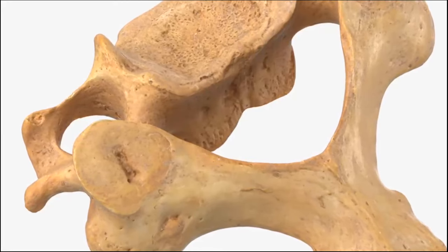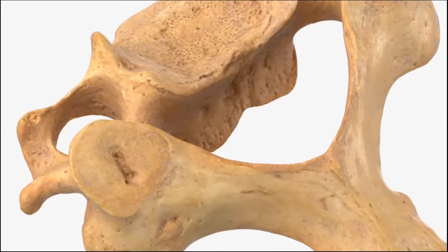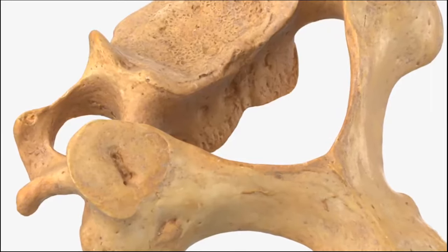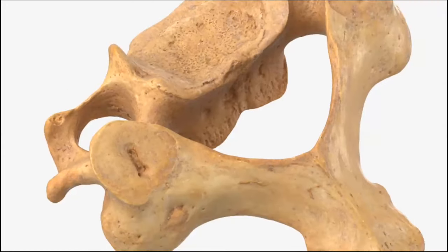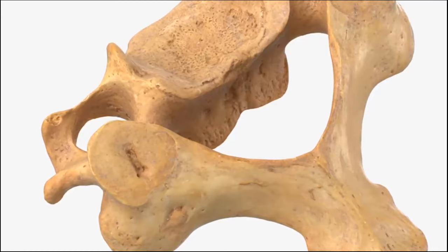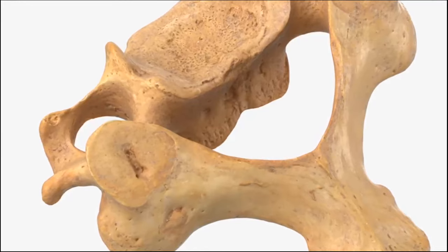As one can notice, the pedicle, which is the part between the superior articular process and the body of a subaxial vertebra, is very, very narrow and very close to the foramen transversarium. Therefore, it is much safer to do a lateral mass fixation. The trajectory of the screw in this case, in contrast to the axis and atlas vertebra, is directed laterally. The foramen transversarium of the subaxial cervical vertebra is located more medially as compared to their lateral masses. And therefore, when the trajectory of the screw is directed laterally, then the screw tip is unlikely to injure the vertebral artery.